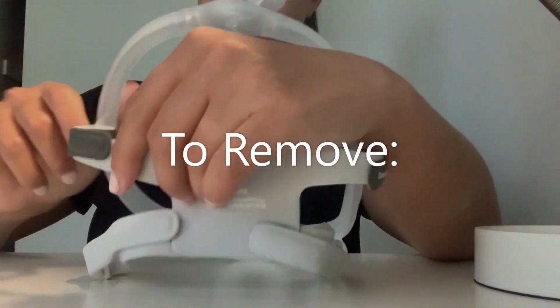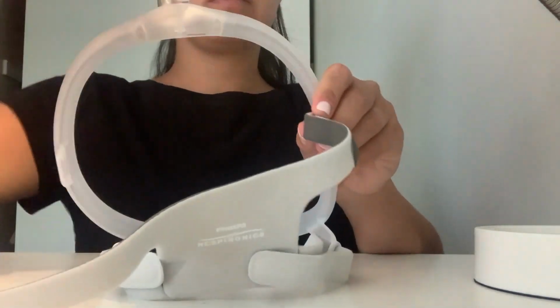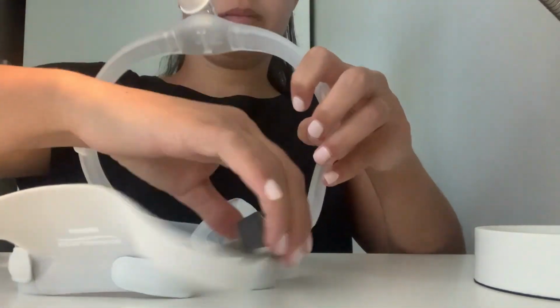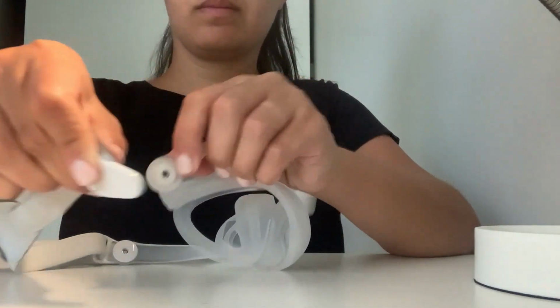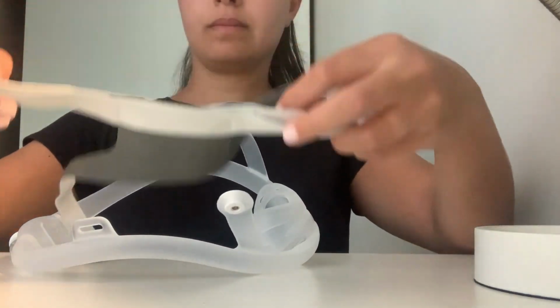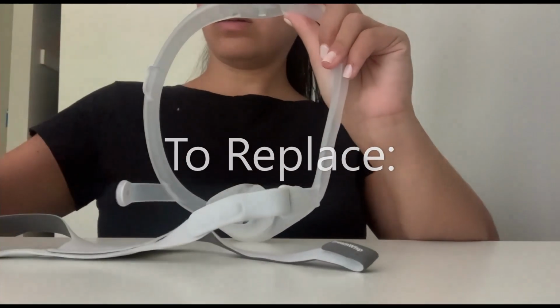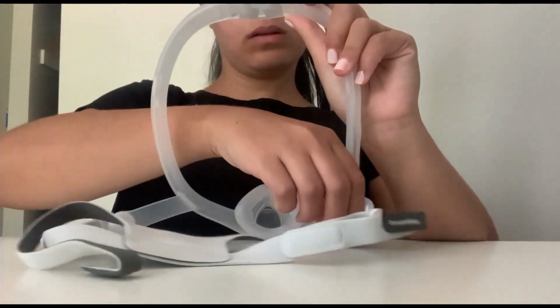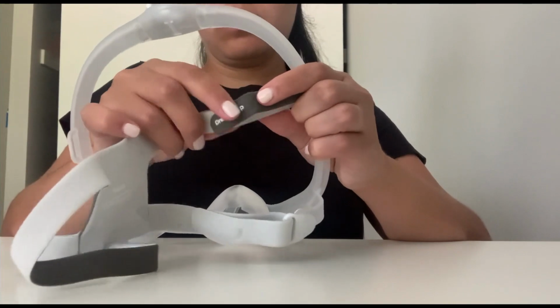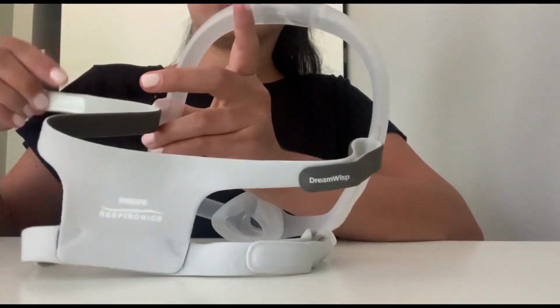To remove the headgear, peel the top headgear tabs away from the fabric and out from its placeholder. Repeat this same process by simply pulling apart the magnetic headgear clips away from the frame. To put on or replace your old headgear, first connect the magnetic clips at the bottom. Then put the upper headgear tabs through their placeholders in the frame, and your headgear will be back together and ready for use with your mask.